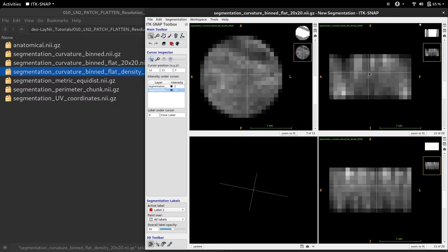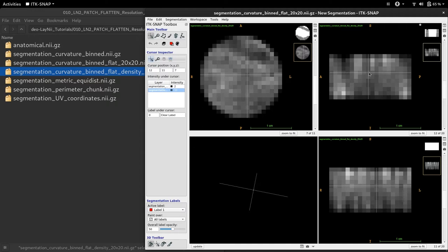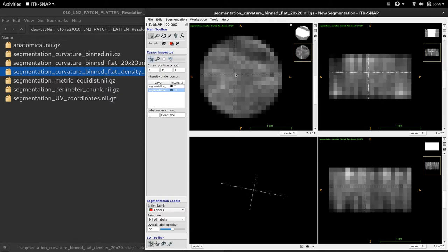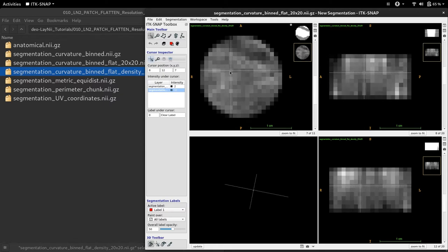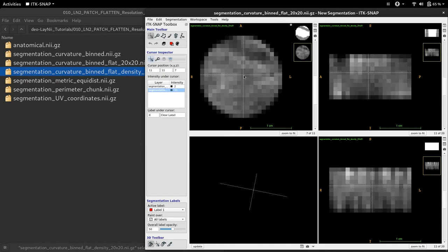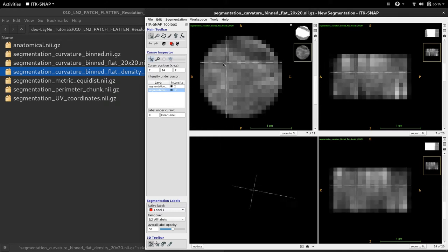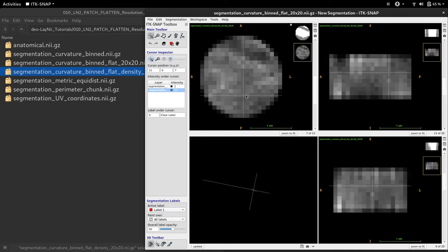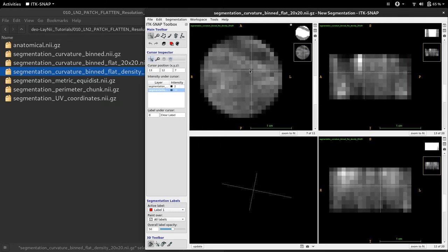You can imagine that if you peel an orange and press it down to a table, some parts will crack where other parts will get denser. This is a similar phenomenon happening, only that we don't have any cracking or tearing apart in this program. From this density representation of our flat cortical brain chunk, what we need to inspect or decide on is how sparse or dense we want this flat cortical brain chunk to be. For instance, this is a very dense flat cortical brain chunk.